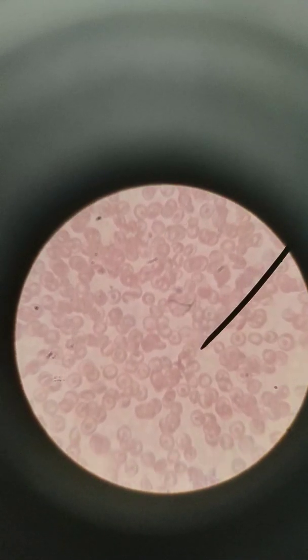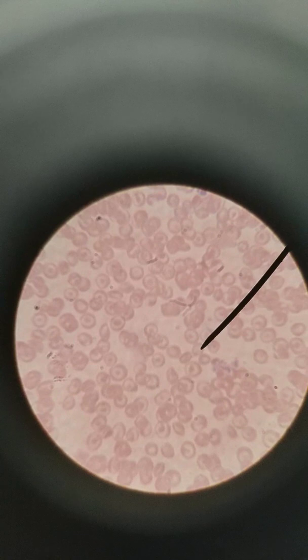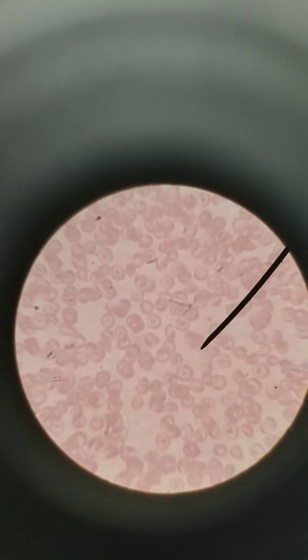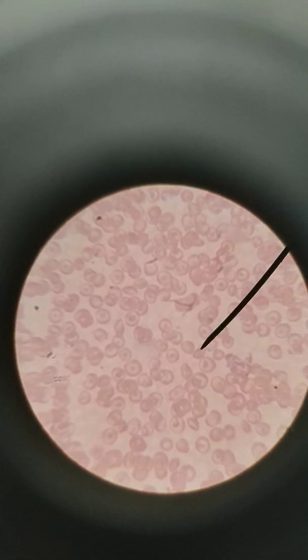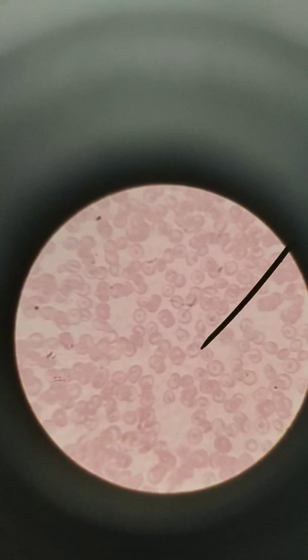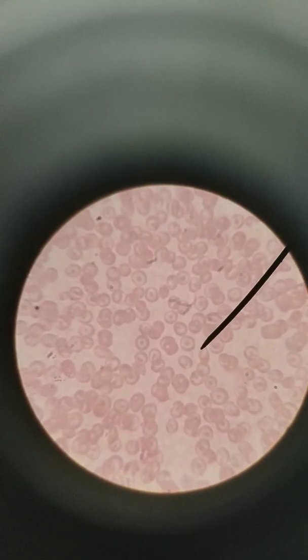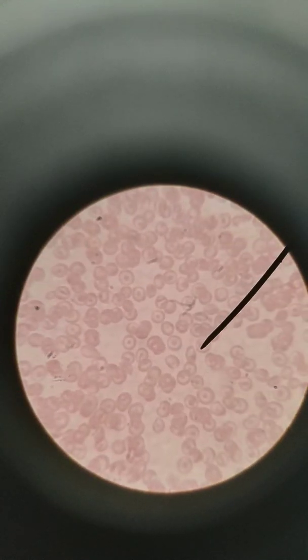What we can also notice in other cells is that some are kind of pointy. Not all of them are round. Like this one that I'm pointing at here, it kind of has a point to it. Let me find another good example. Here, this one. This one is pointy. This one here is pointy.